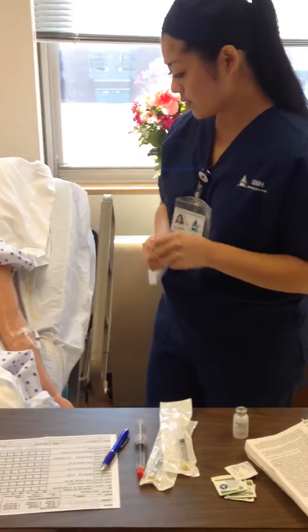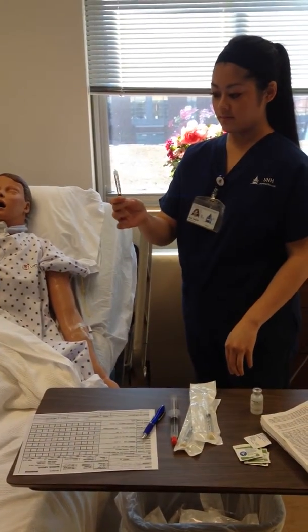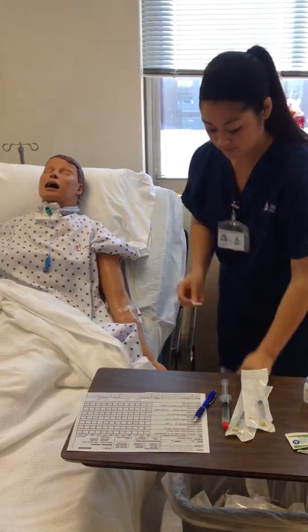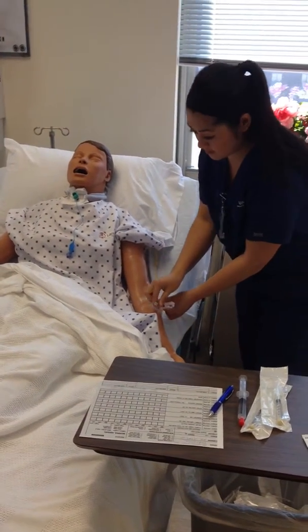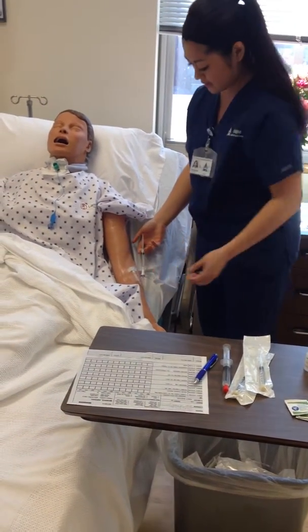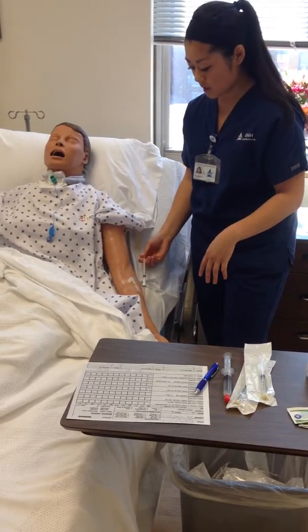And now it's time to flush the line and make sure it's patent. So we want to assess, is this hurting the patient? Is there any redness? Please scrub the hub. We're going to scrub the hub. And we're going to push the saline in, making sure that's not burning the patient, making sure it's not difficult to get the saline in, just making sure the line is patent.